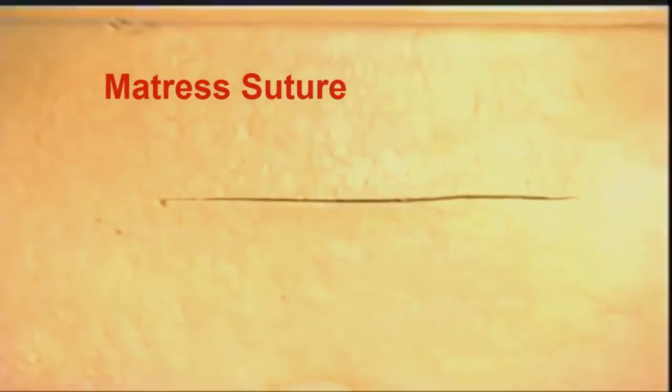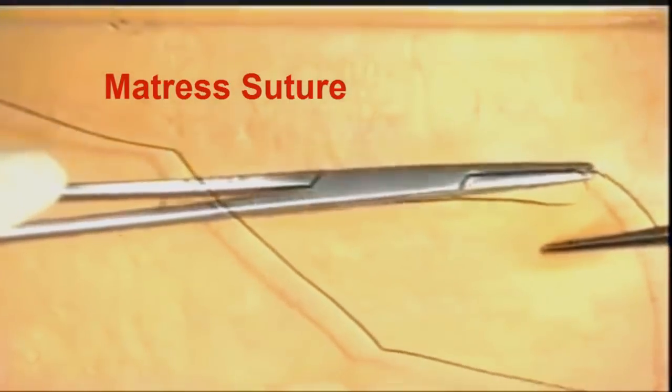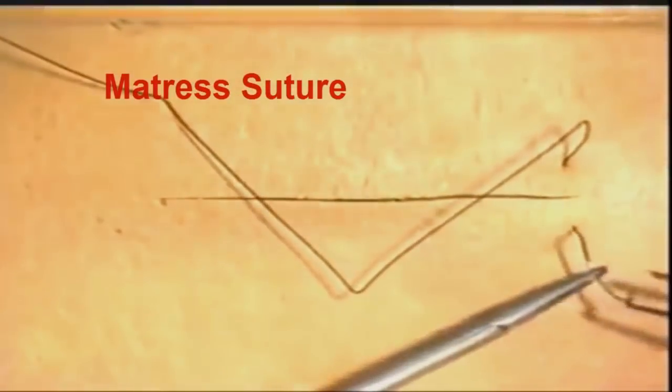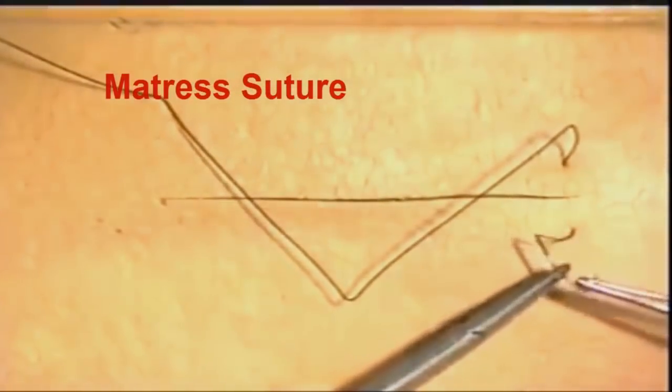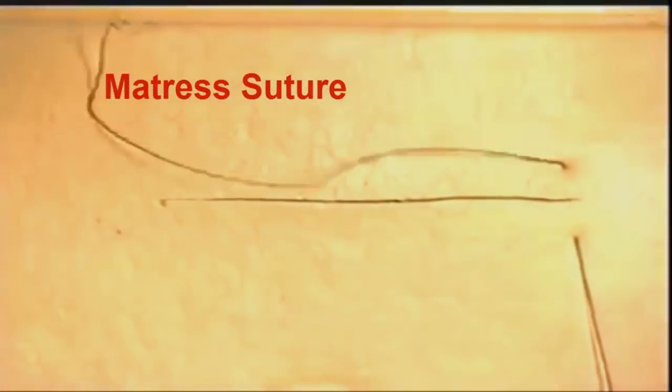Mattress sutures can be inserted to allow for eversion or inversion, and can also be used for irregular skin edges. We will demonstrate here a vertical mattress suture. The suture is put in in the standard manner, the needle is reversed, and then taking just a small bite of the skin edges, the suture is completed and a reef knot tied.